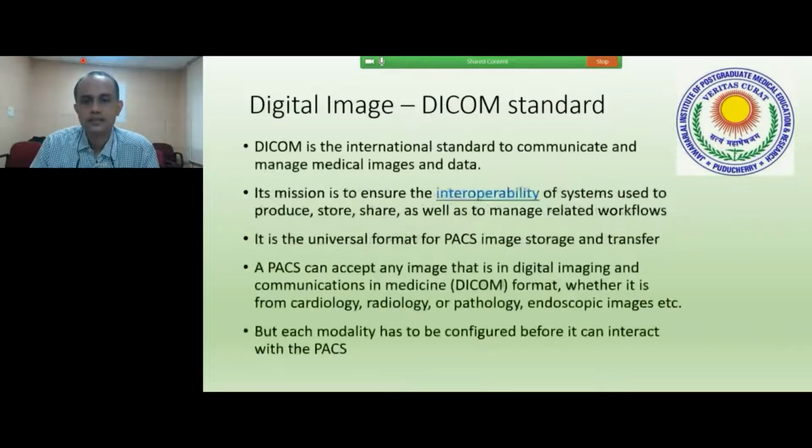DICOM is the international standard to communicate and manage medical images and data. Its mission is to ensure interoperability so that images from different vendors can easily be seen simultaneously within the PACS. So production, storage, sharing, as well as all related workflows are easily managed if the image corresponds to a DICOM standard. So it is the universal format for PACS image storage and transfer. So without DICOM, it is not possible to establish a PACS.